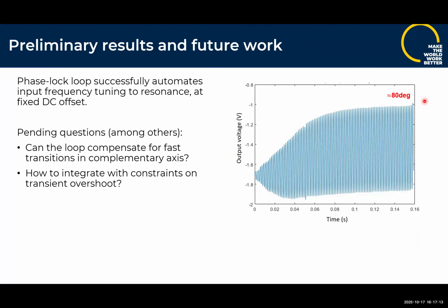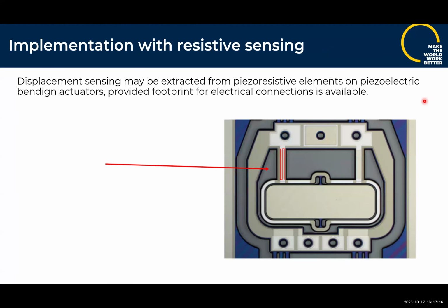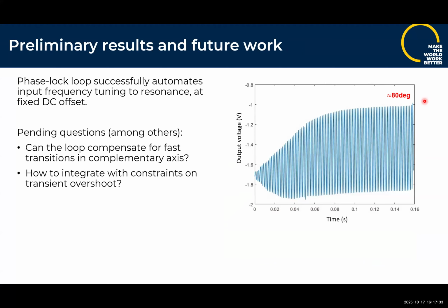Okay, these are slides where certain images just keep disappearing when I open and close this program. We finally, with the piezoelectric device, do have some real estate for sensing. So what this was supposed to show, there's a small piezoresistor along these piezoelectric legs that's picking up the motion signal. And at least on the bench top, he just starts initiating the motion, runs it through the phase lock loop, and based on some arbitrary choice of nearby frequency, he's got a little bit of motion, and then running a phase lock loop, you can drive it towards near its optimal frequency.